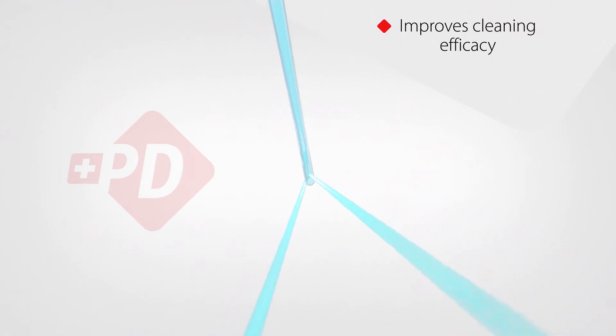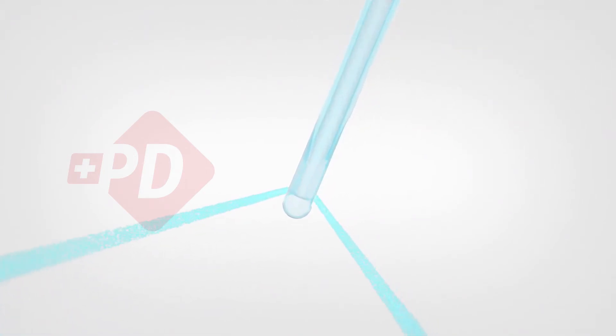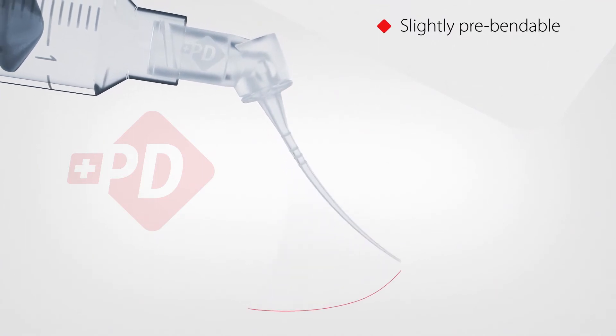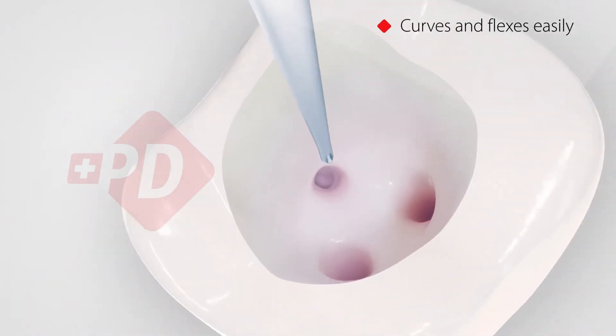The unique closed-ended, two-side vent needle design delivers solutions as close to the apex as possible. The horizontal flow and the specific taper increase the shear stress effect in the entire root canal system for more efficient cleaning results.